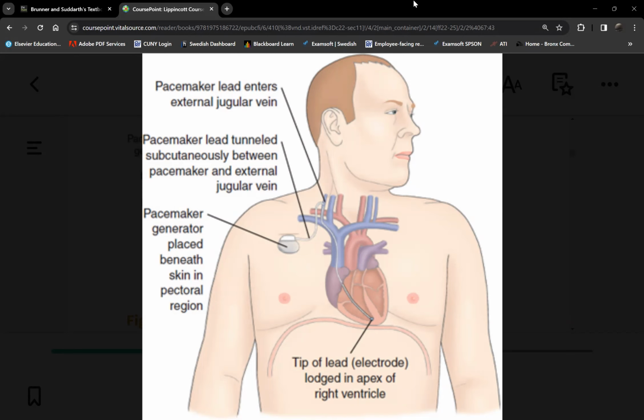No. Well, it's inside. Will they get infected? Absolutely. Okay, but it's not staying there permanently anyway. We're taking that out. So we'll just wait until the infection clears. Once the patient finishes the course of antibiotics and they're infection free, we'll take it out. Then we'll put in the permanent pacemaker. Does that make sense? So that's usually the scenario why someone would require a transvenous pacemaker. Call it a bridge between the permanent and the temporary.